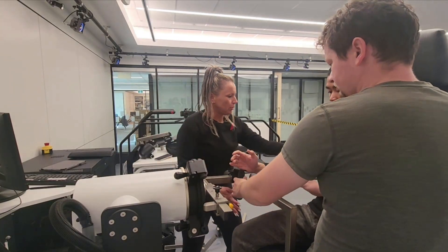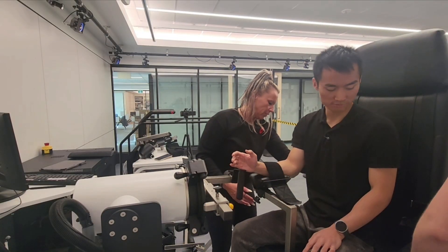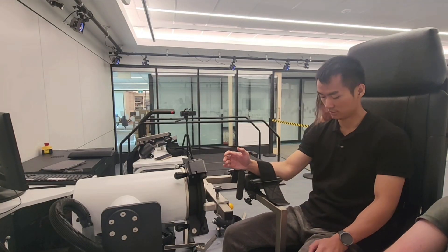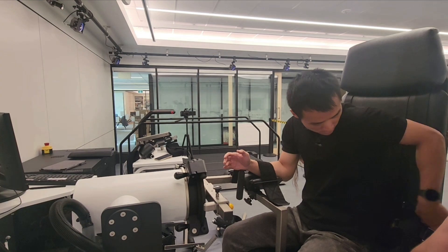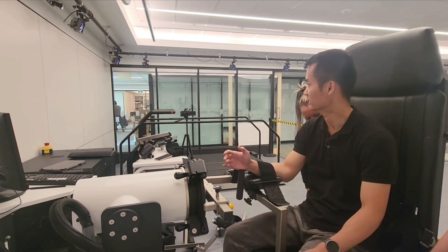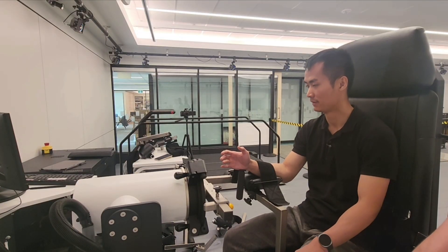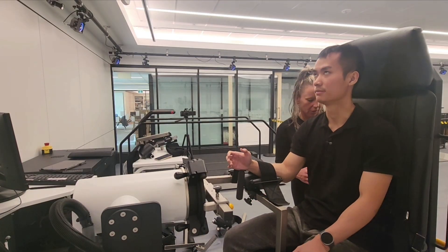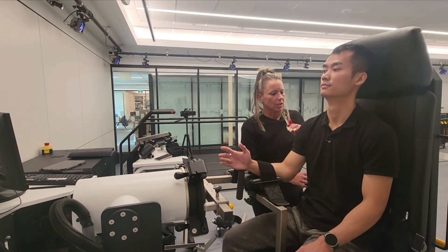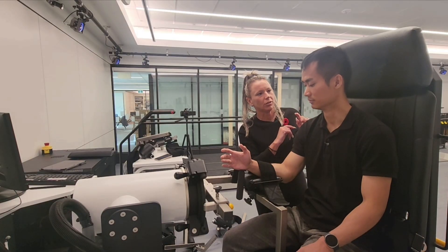Things we can do: we can move you closer, we can move you farther. I feel like I want to move closer. We're going to bring you closer this time. So this distance is going to represent more thigh length. As long as the person is comfortable, we'll let you try it without the arm seatbelt on and you can see if you like it or don't.